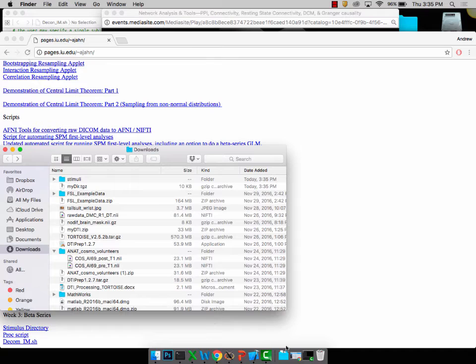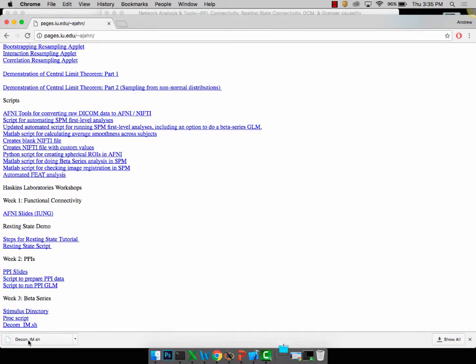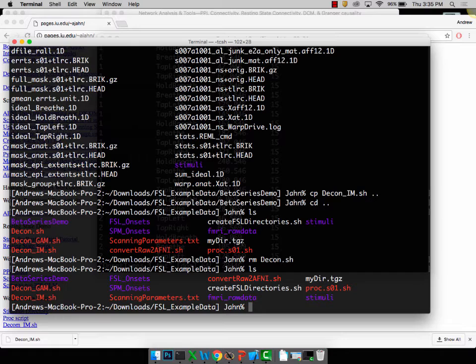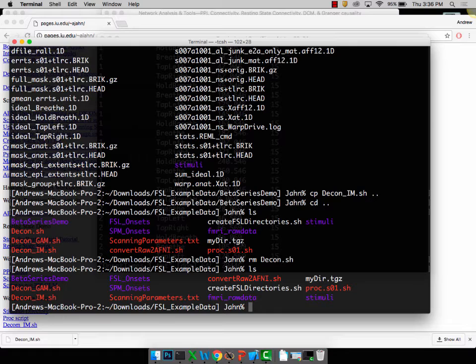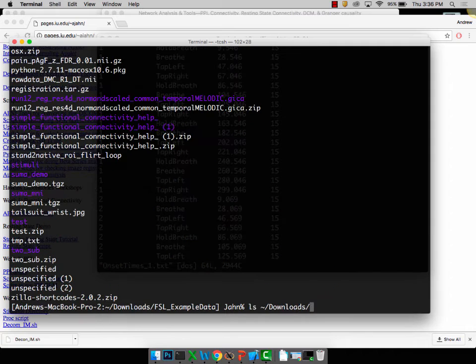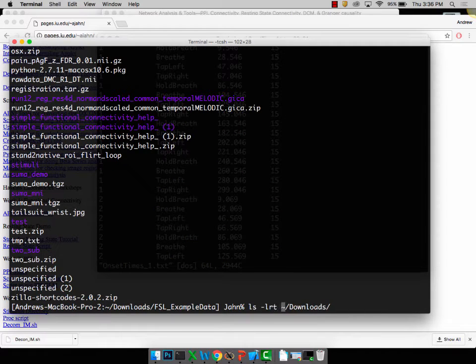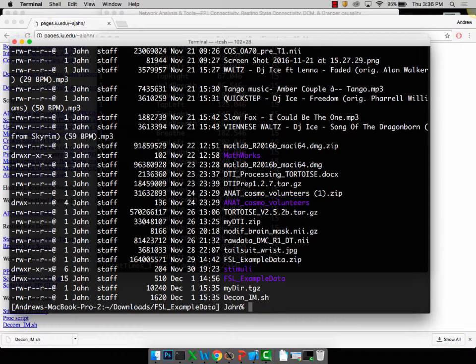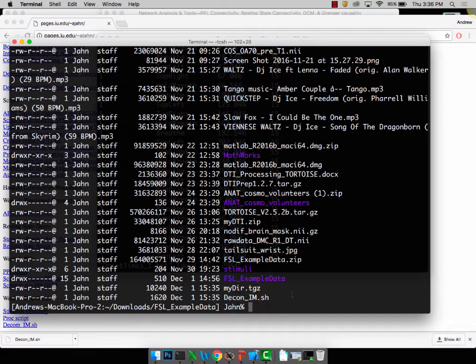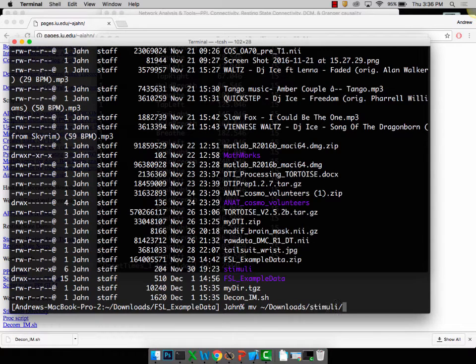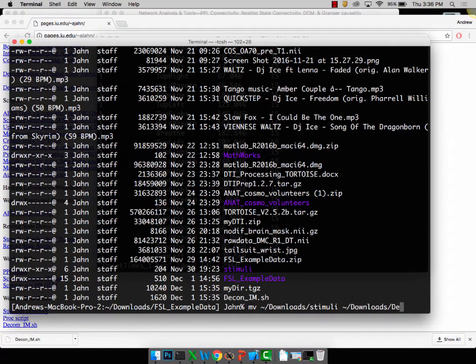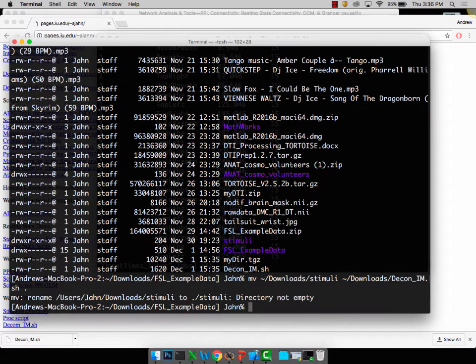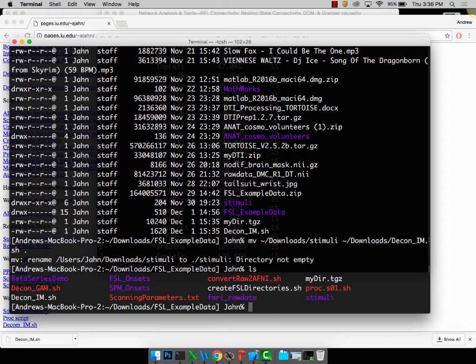What I want you to do is first download stimuli, download dcon underscore im. Those should be in your download folder. Has anybody not downloaded FSL example data? So wherever that directory is, move the stimulus folder, which for me is in downloads.